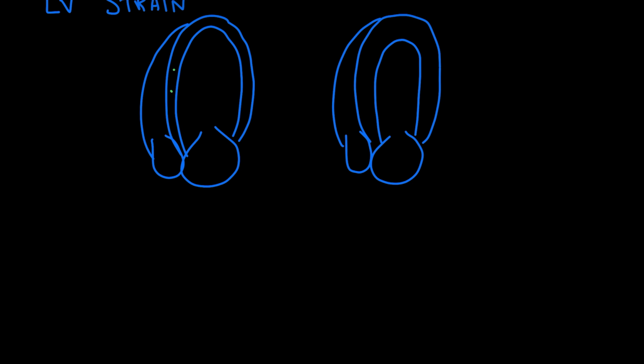This is where those 2 points would be in diastole. And then during systole, those points may actually come closer together. And what the machine does for us is it basically calculates the change in length divided by the total length, and that concept is equal to strain. And I've shown longitudinal strain. Now I could also, if I picked these 2 points here, and we see how those get farther apart, that would be looking at radial strain.